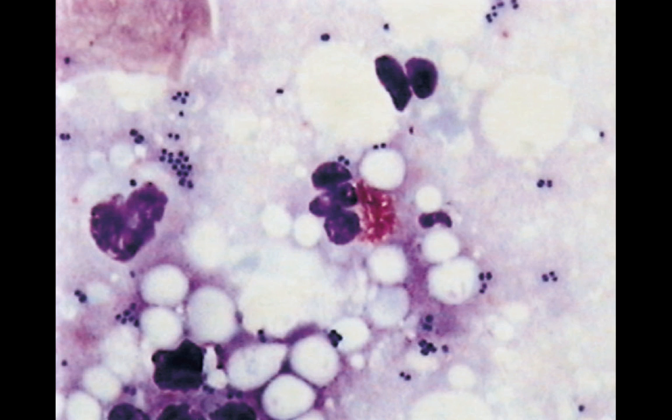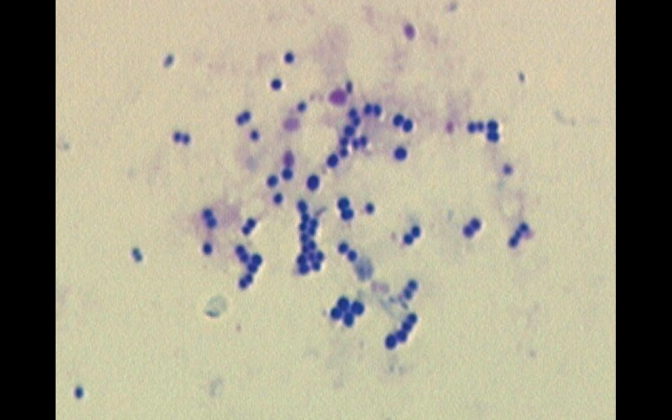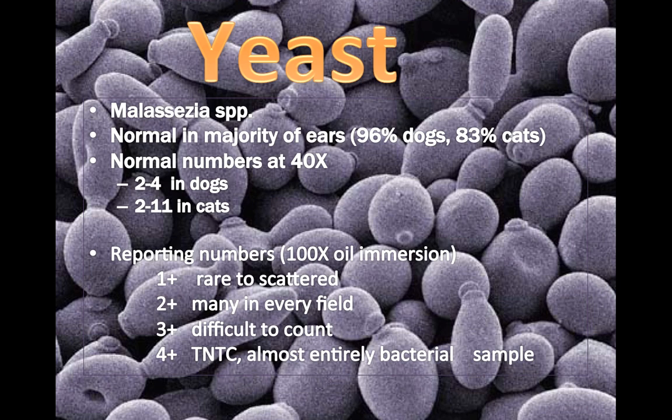This is an ear swab showing lots of beautiful cocci bacteria — beautiful to look at, not so great for the dog — along with degenerate neutrophils. These are neutrophils; they're degenerate, and we'll talk about them in detail during the inflammation section. Here we have more cocci and some rods around a keratinocyte.